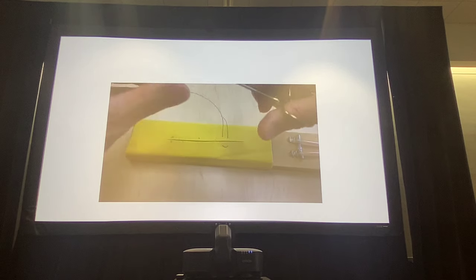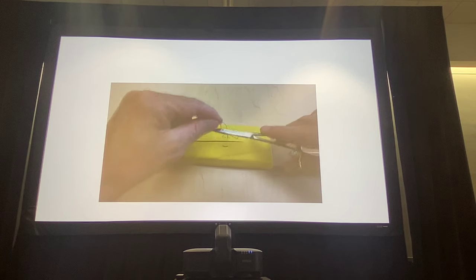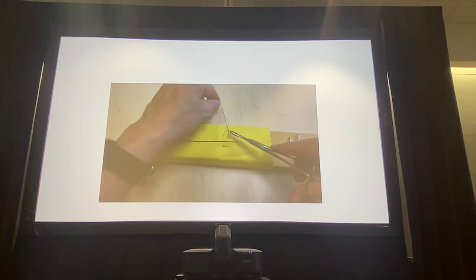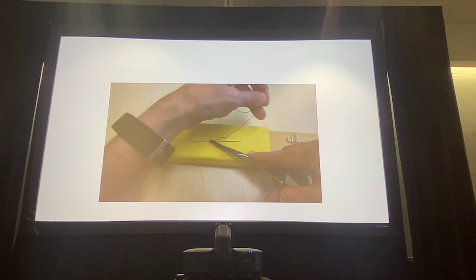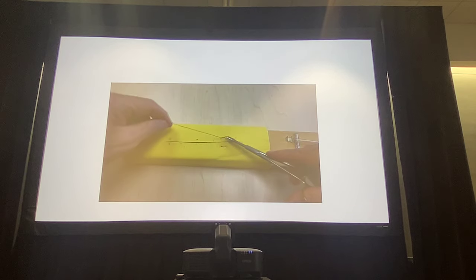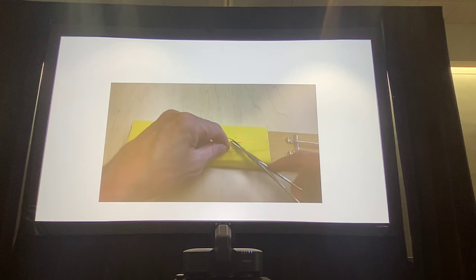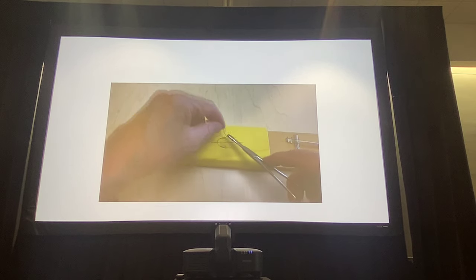Subcutaneous tissue? Yes. So the question is, can you do this in subcutaneous tissue? Yes, you could. The reason you may find it frustrating in the sub-Q is because the sub-Q is mostly fat, and you may find that your suture pulls through. This pattern creates such strong tension that you might have that problem.